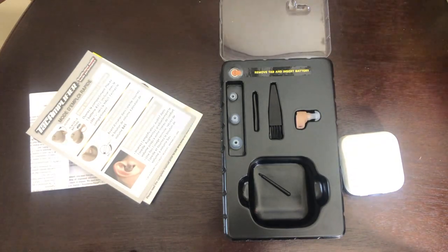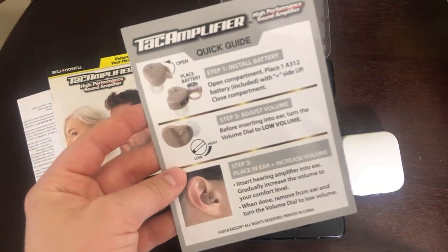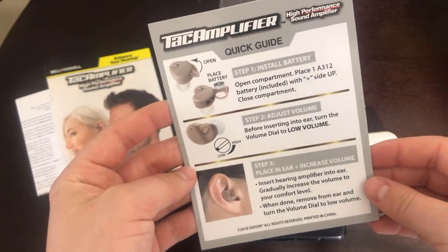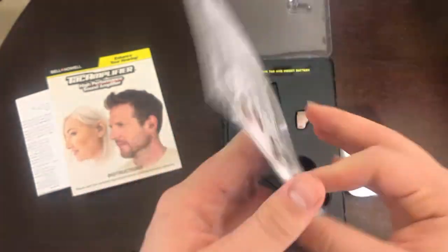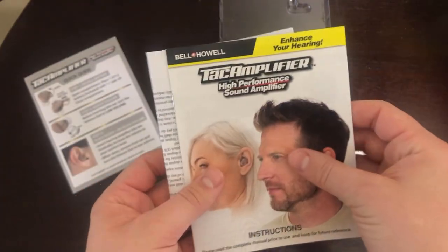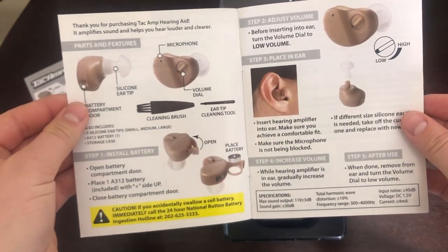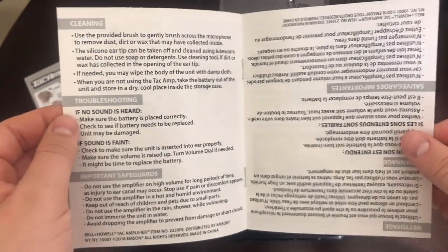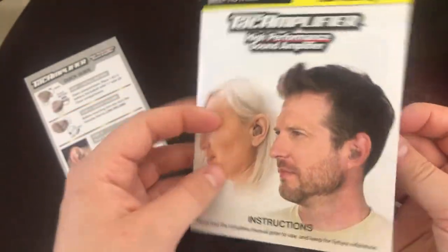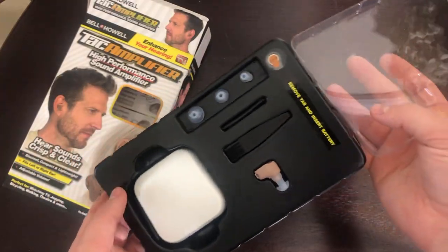Here is the product and some instructions. These instructions illustrate how to put the battery in and how to use the component to the best of its ability — there's volume control and how to put it in your ear. It supposedly can work in both ears, and it shows how each part you're given works, all the cleaning tools, and how to troubleshoot if you have any issues.